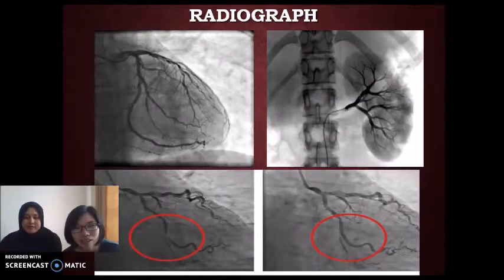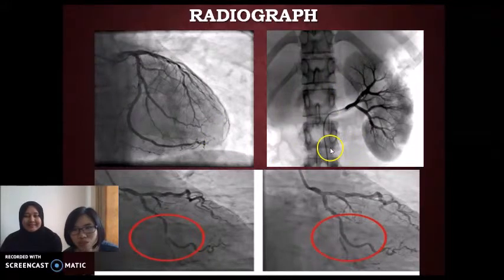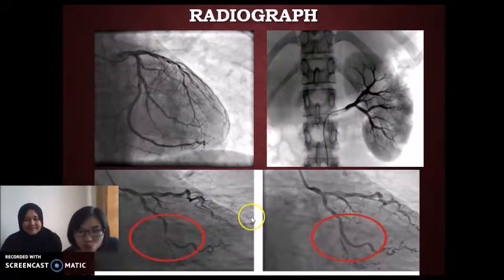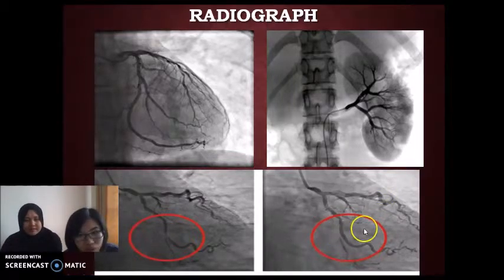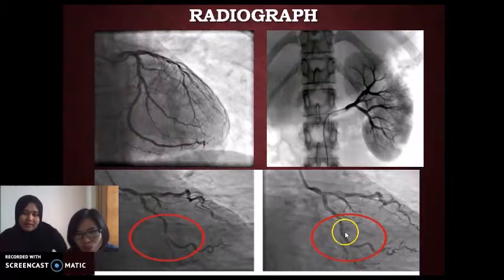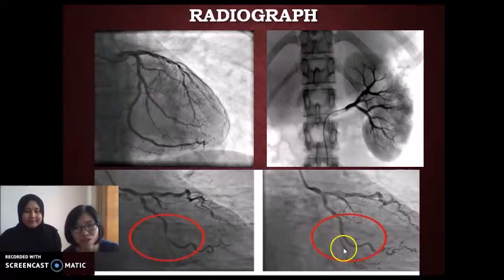Next, this is the typical appearance of an angiographic image. This one is a common procedure, and this one is the angio for the kidney. These two images show that this patient does have a stenosis here. Then the patient will undergo treatment immediately in the angiography suite, usually balloon angioplasty or stenting. We will do stenting for this kind of stenosis.